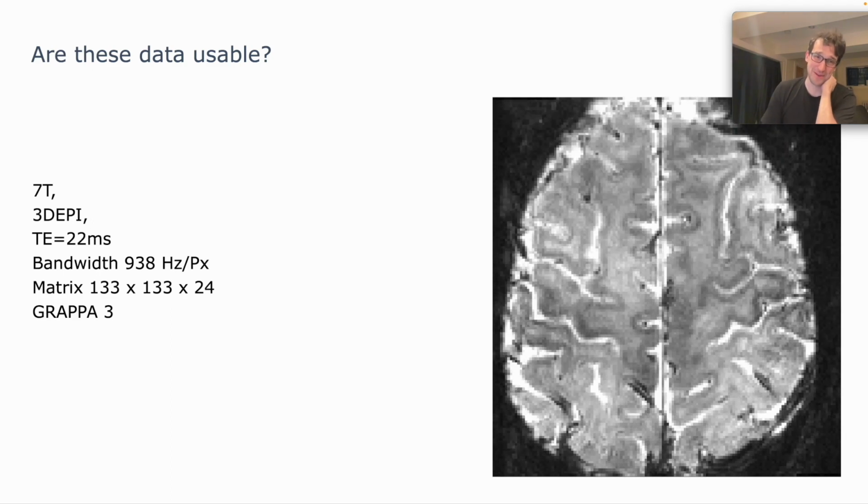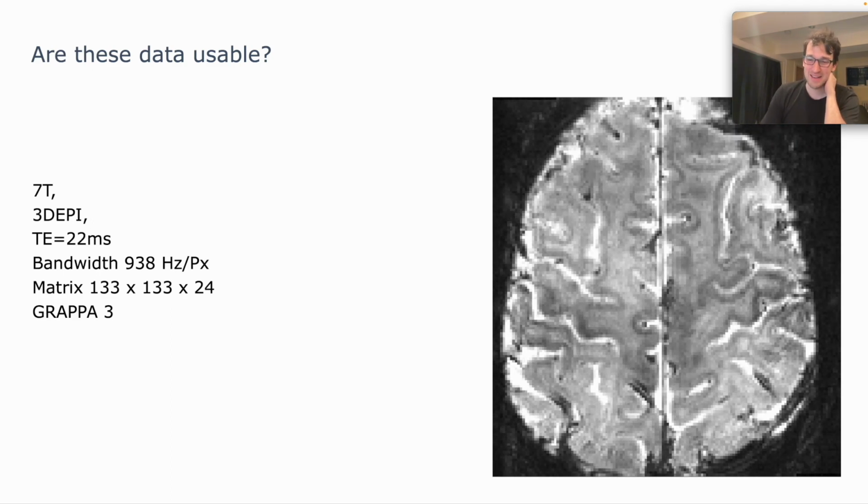Maybe, right? Depends on the question, I guess. I'm asking it because recently in these discussions in the field, for example, with respect to the AFNI QA special issue, there were these very puristic scientists who rejected more than 90% of the data, saying they are unusable. So very often we want to have the best data that we can get, and sometimes it makes you a better scientist if you only work with the best data and have the highest quality standards. But in the end, a scientist who doesn't have data is also not a good scientist. So we need to find our compromise there.